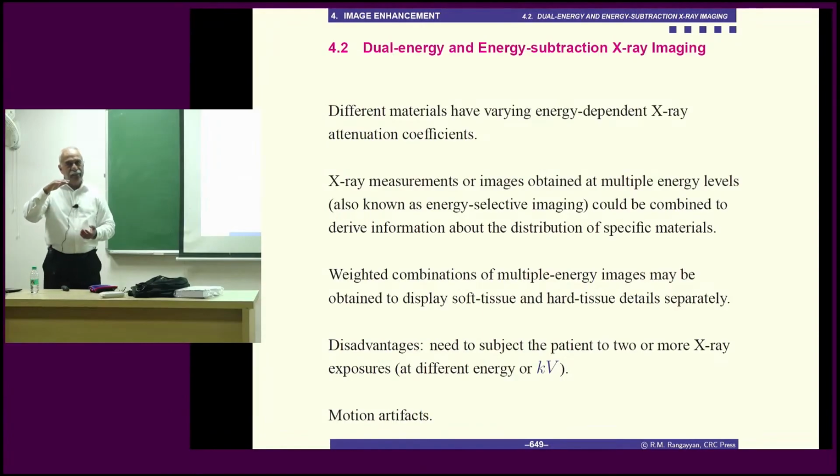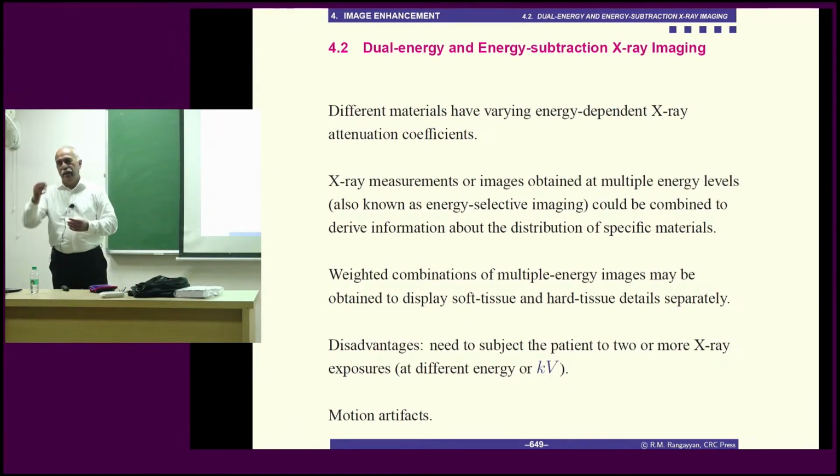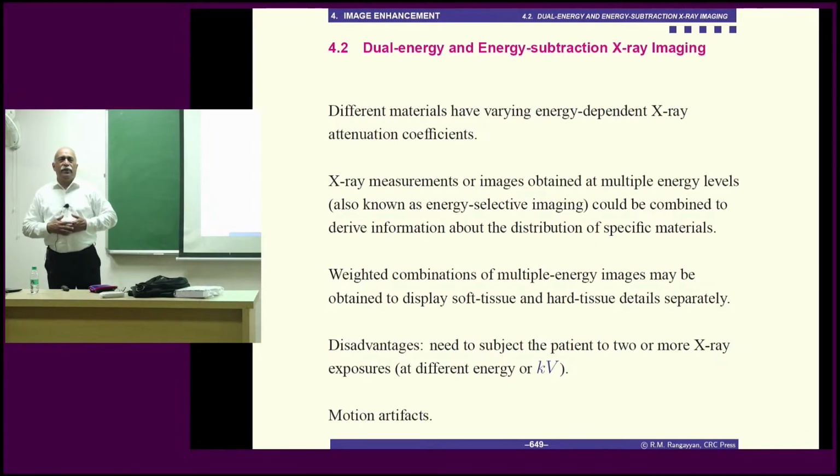The filters will stop some of the soft X-rays. The X-rays have already passed through the body, but within the spectrum of the X-rays, there are low energy photons and high energy photons. High energy photons have already come through the body, and some low energy photons would have been absorbed right away at the skin. Those are not important. Others have been attenuated by passing through the soft tissues. They contain important information. But you want to separate that spectrum.